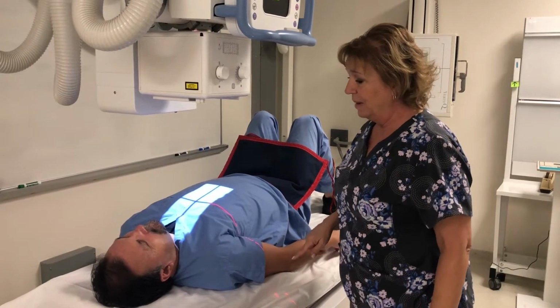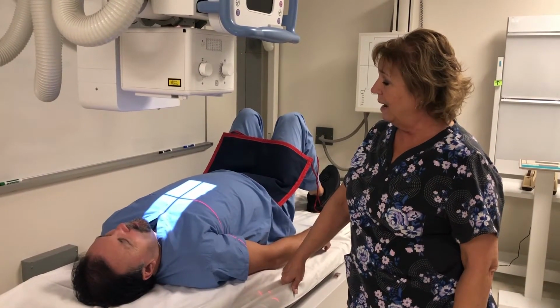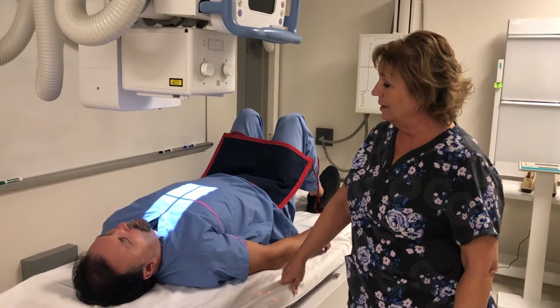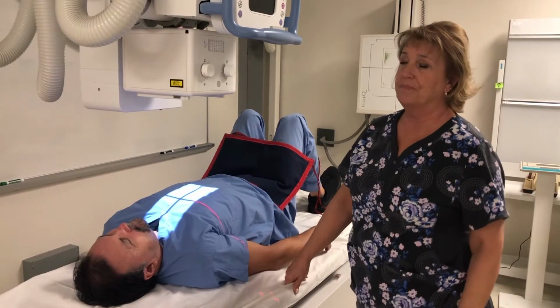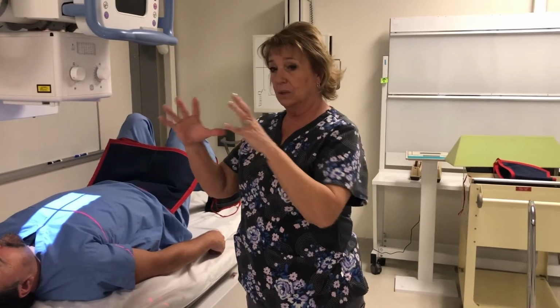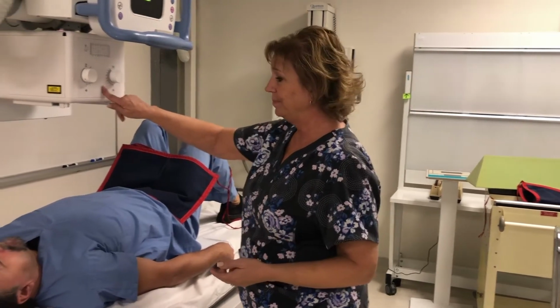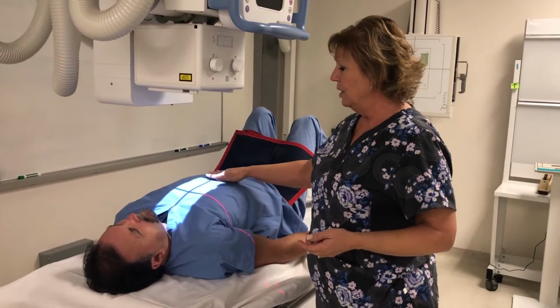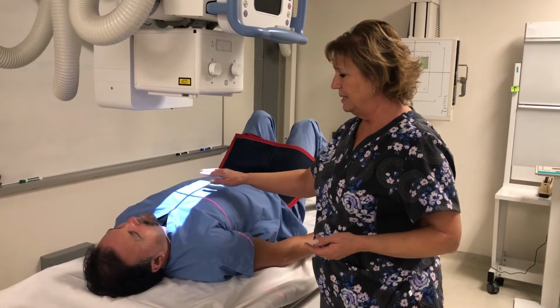And for the AP thoracic, you're going to have the patient take in a breath, blow it all the way out, blow all your air out, stop breathing, expose. You can breathe. What that does is raise the diaphragm, gets rid of a lot of the black looking part of the lungs that on inhalation would look black. You see the lung markings, and it just makes a more even density from top to bottom. So that is our AP thoracic spine centered at the level of T7, 7 by 17 inch collimation.